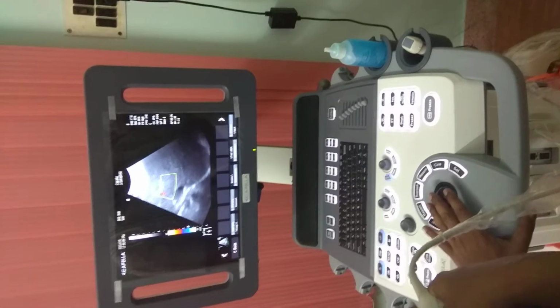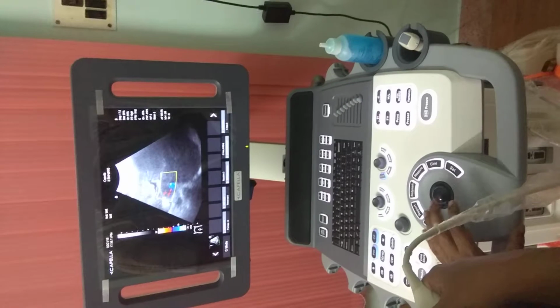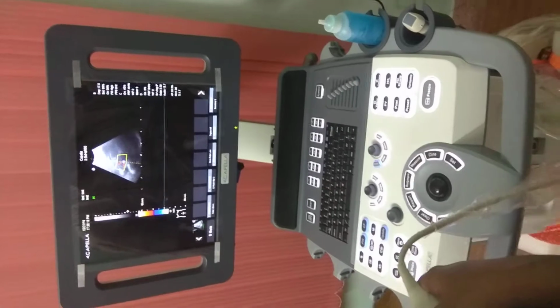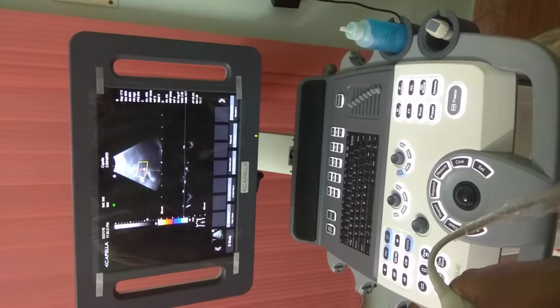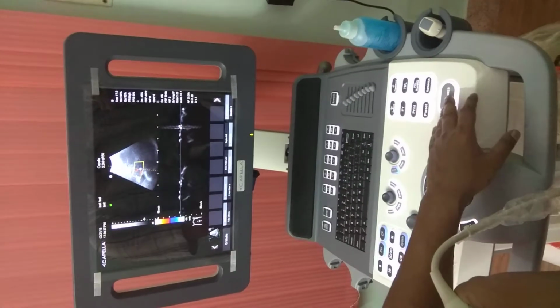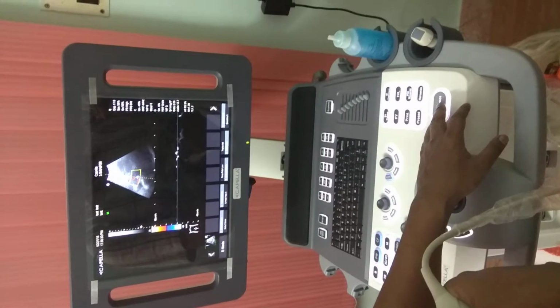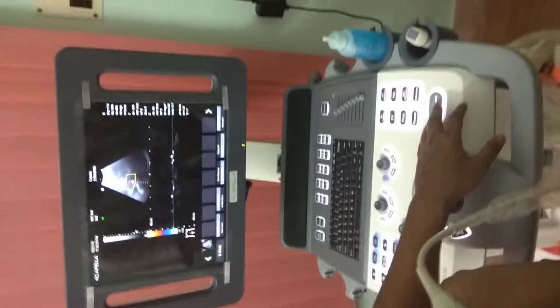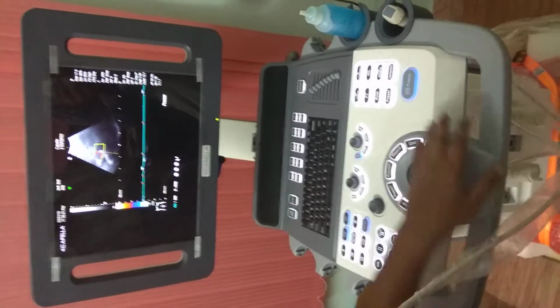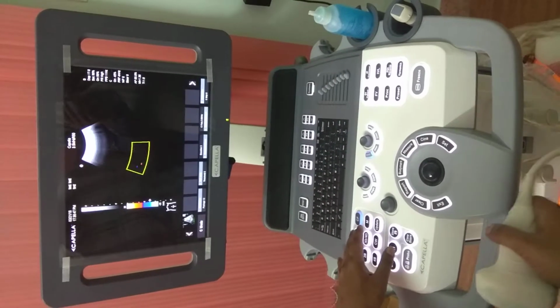And for a smaller and more accurate output, you can go to PW and, okay, then if you just maybe go out.